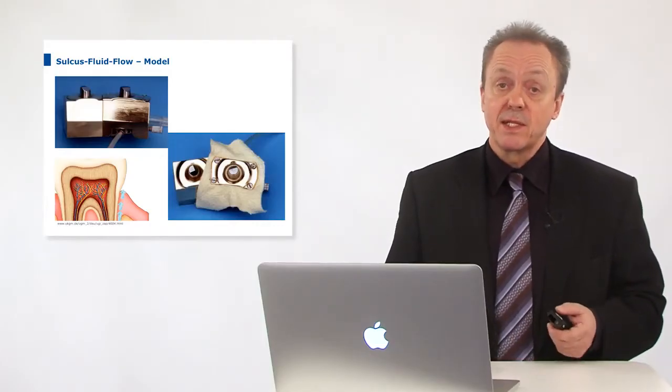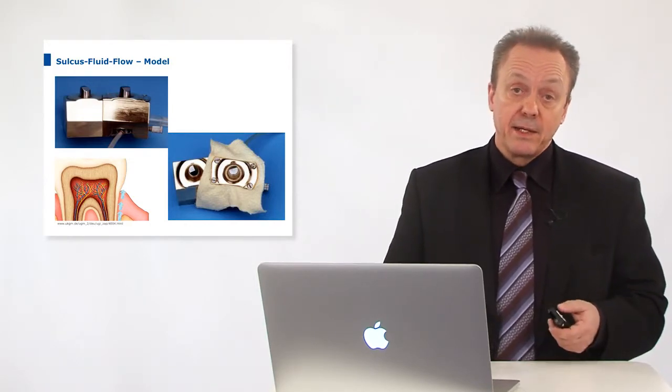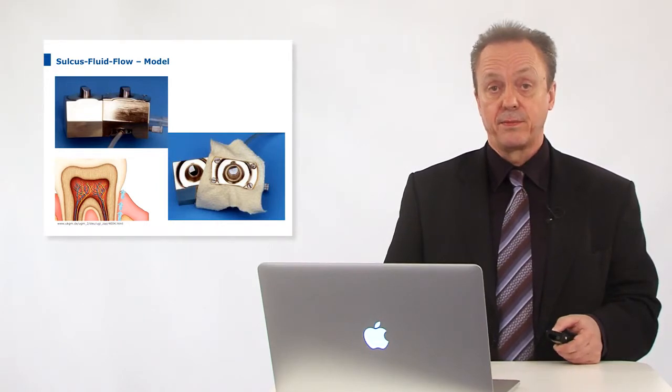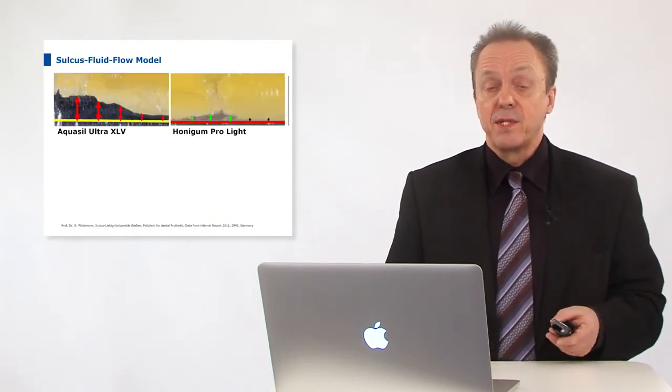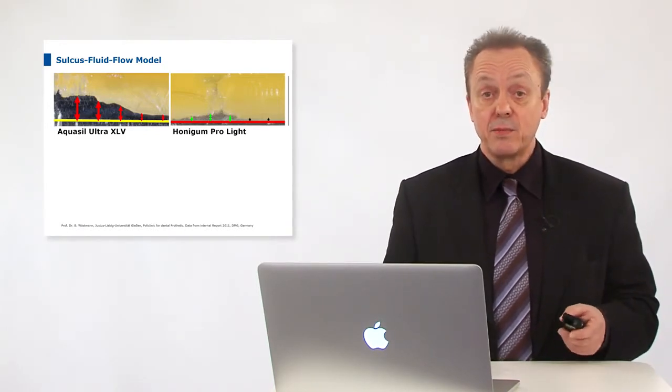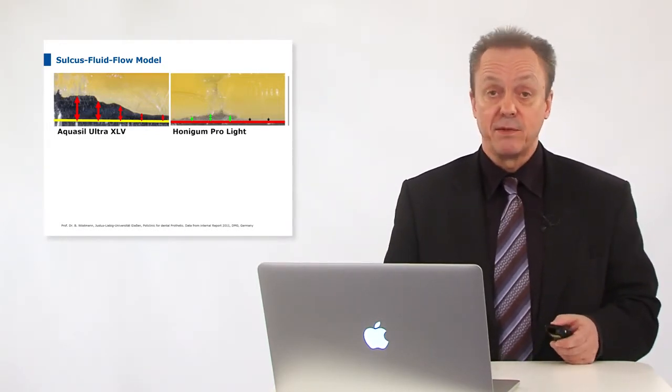The experimental setup includes idealized preparations to simulate a wet sulcus. Here they have used different kinds of light-bodied materials, and Honigum Pro Light was the reference material.